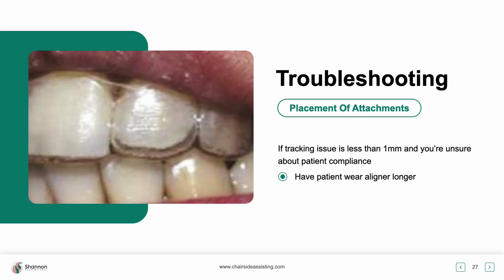Now listen, the template is sacred. You don't want to poke a hole in it. I heard one speaker one time tell people to poke a little hole in it so the composite can squeeze out. Are you crazy? You never, ever do anything to manipulate the template. The other thing is, I heard somebody using Pam or Vaseline, so this way they didn't have as much flash. You are inhibiting bond strengths. Whoever said that should never be able to lecture to another person ever as long as they live.